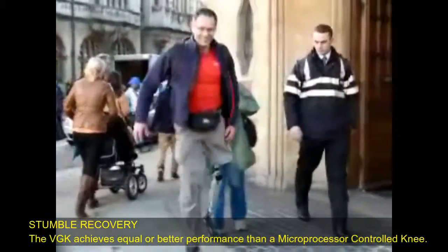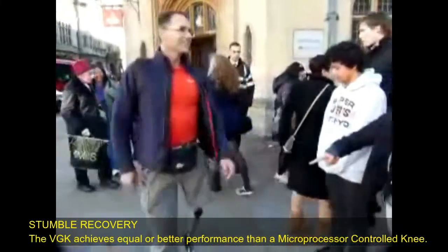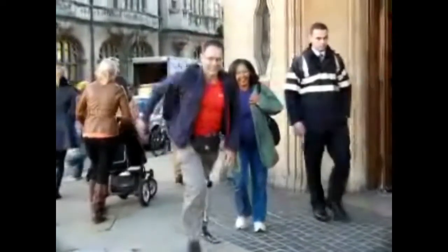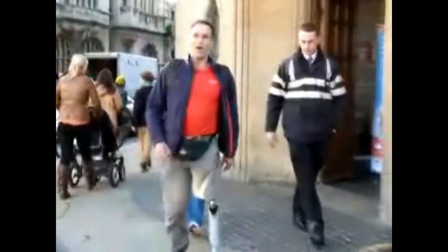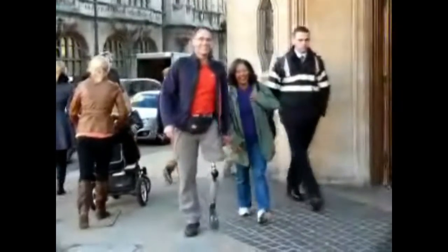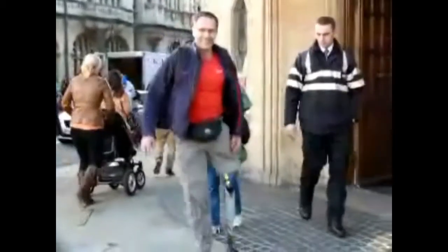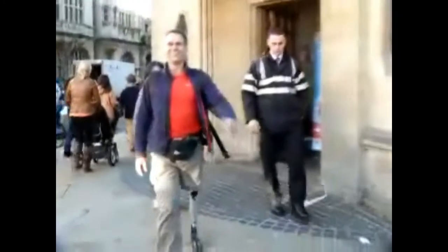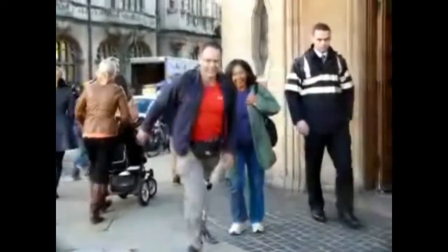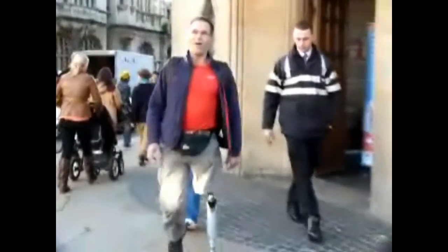Now, one of the key features that this knee has that's very unusual is stumble recovery. Now, as far as we know at this point, there is no video of stumble recovery happening in real time. And we believe this is the only video of that happening in real time. Notice when it slows down, watch the toe. You'll see him catch his toe on the cobblestone when he goes from the smooth cement to cobblestone. And when he lands on a bent knee, somehow this knee knew to lock up and give him time to get to the next foot. And that's the important part.